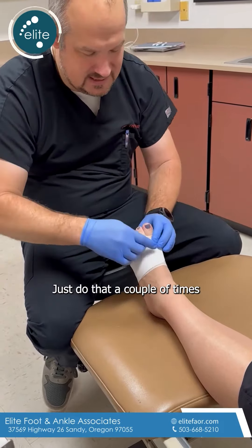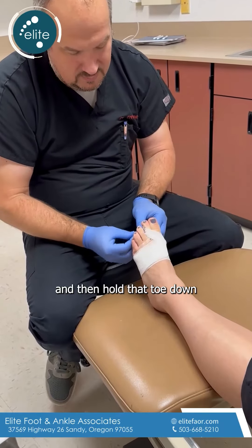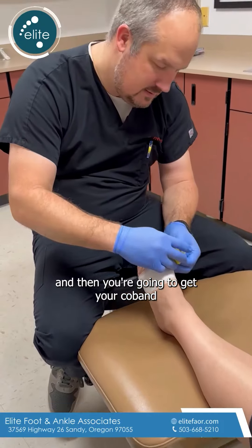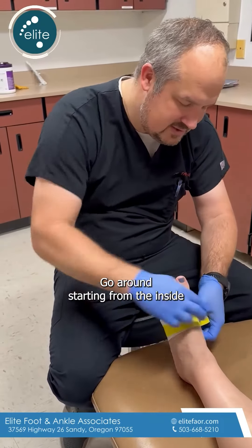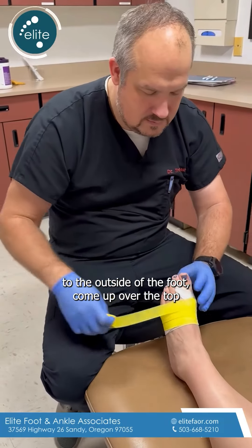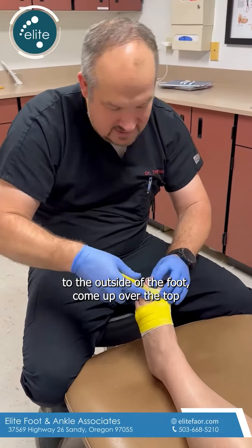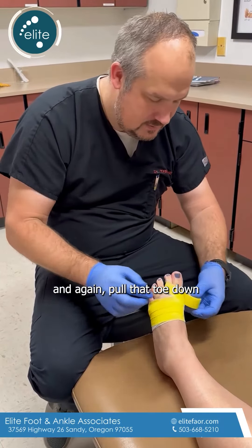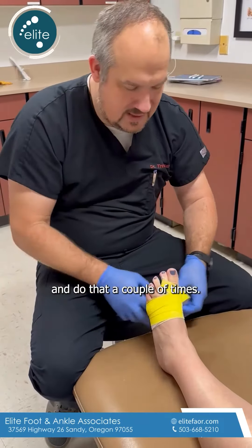Do that a couple of times, hold that toe down, and then you're going to get your co-ban and do the same sort of thing — go around starting from the inside to the outside of the foot, come up over the top, and again pull that toe down. Do that a couple of times.